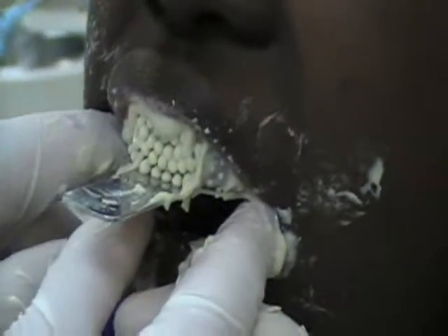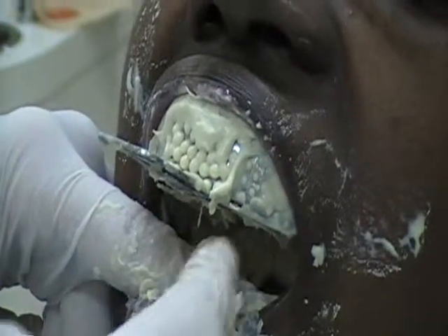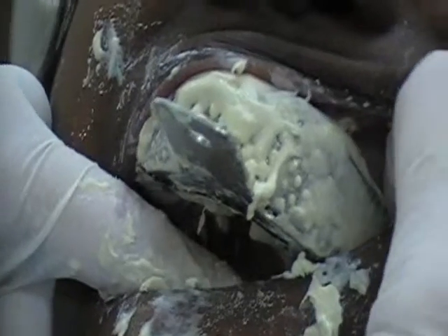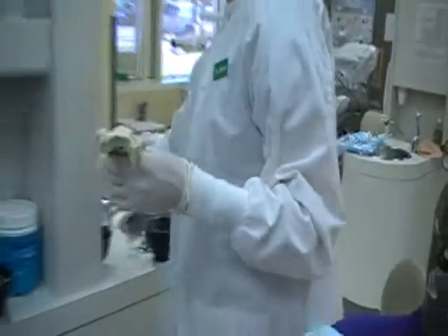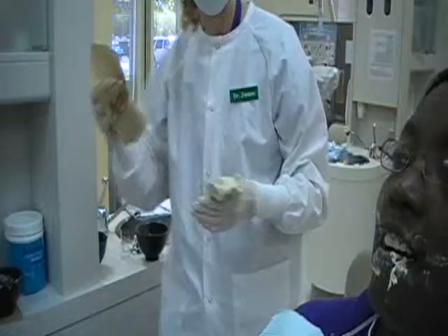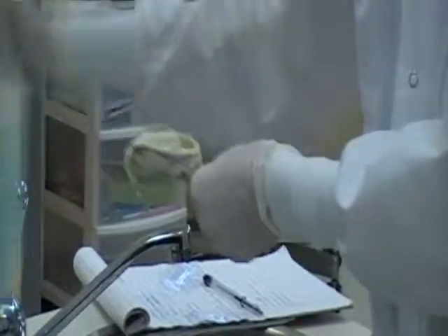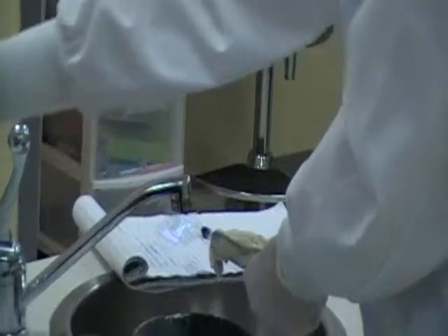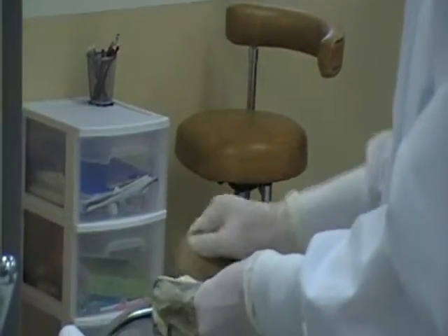You'll lean your head back now. I'm going to remove this very, very quickly. Just like before, you want to protect her lower teeth with one of your fingers. We're going to remove this with a quick snap — I break the seal on one of the sides and then remove it very quickly to avoid distortion. I'm looking and I've got all the teeth, even to the third molars, recorded. We're going to give her a wet paper towel to clean up with. Again, I'm going to rinse and then disinfect, then wrap with a damp paper towel. And that's the procedure for doing alginate impressions.